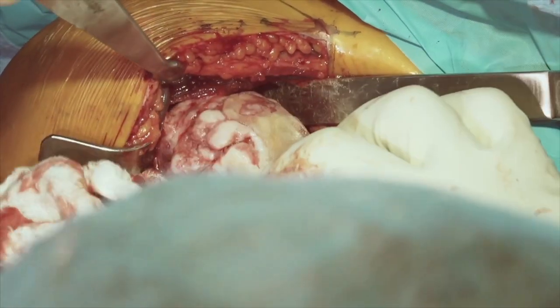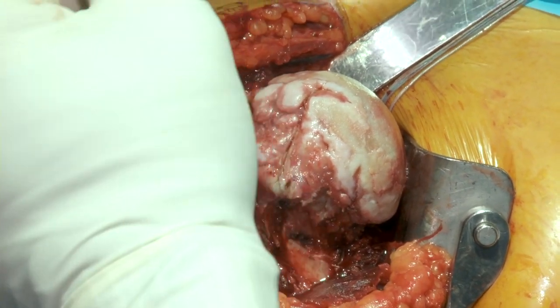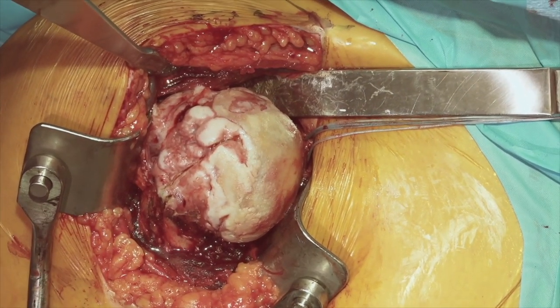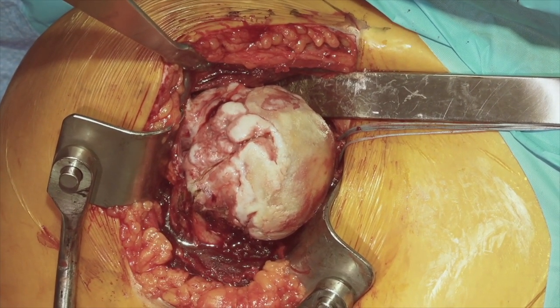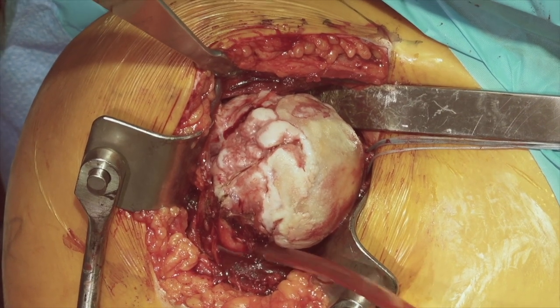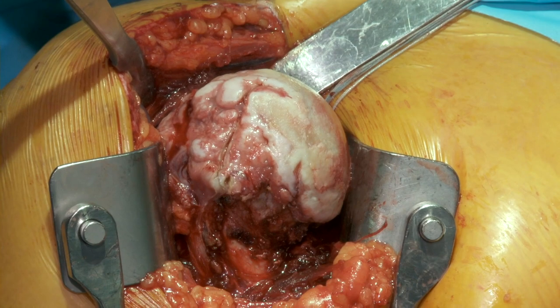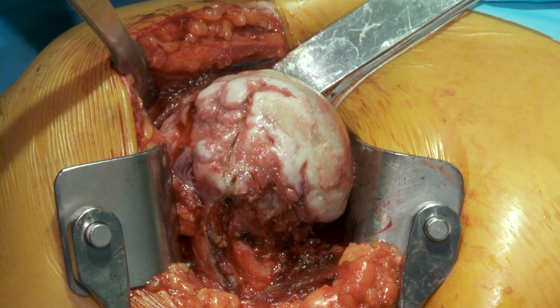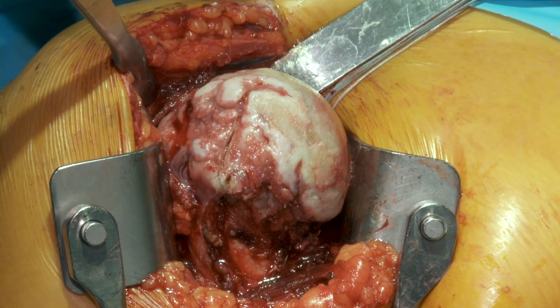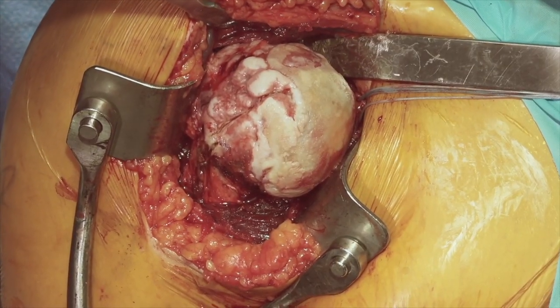These can be quite challenging in terms of figuring out exactly where to make your humeral head cut. In an effort to identify the best position, we'll use a humeral cutting guide to formalize our cut. There are two different styles of arthroplasty: one with the typical Grammont-style 155-degree inclination on the humeral side and another with the 135. There are now other devices that allow something in between those two inclinations as a compromise. We've identified that the 135-degree inclination minimizes the risk of notching and does not increase the risk of instability.